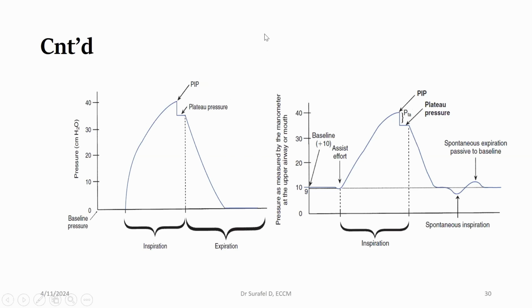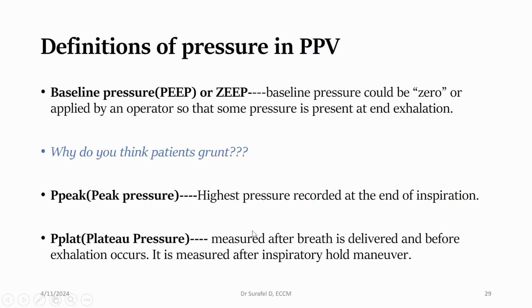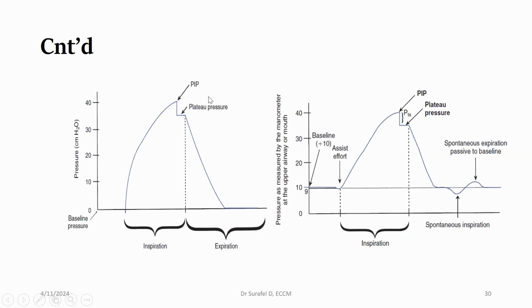Is this concept clear? Clear. So you need to have an inspiratory hold maneuver.